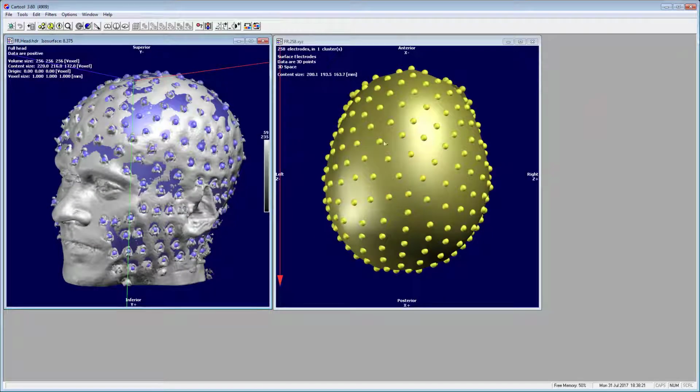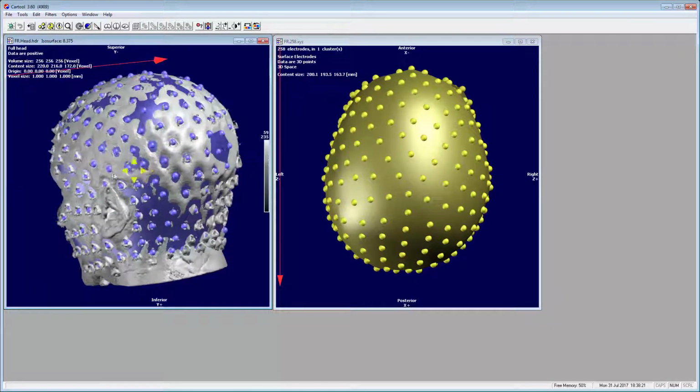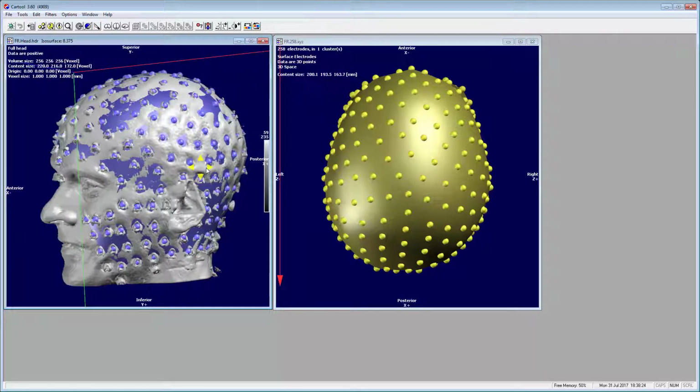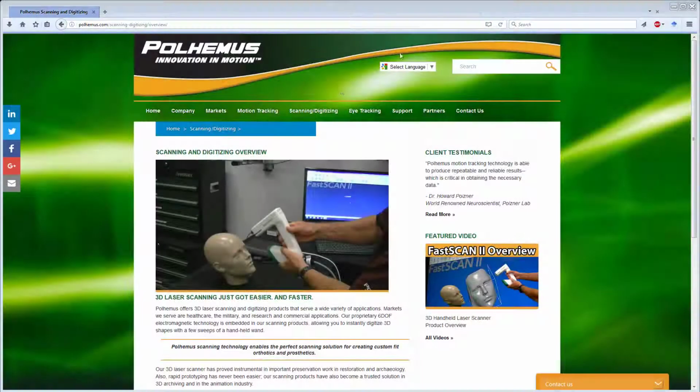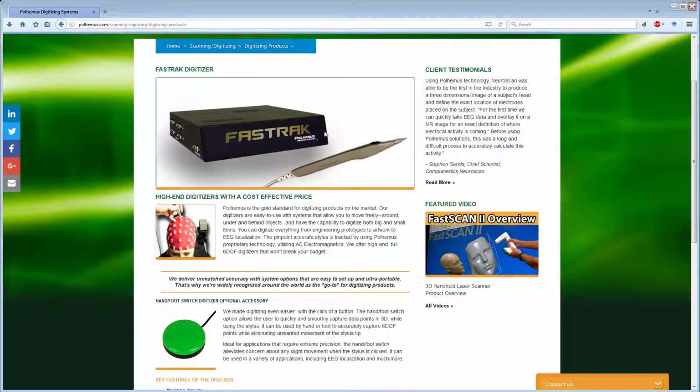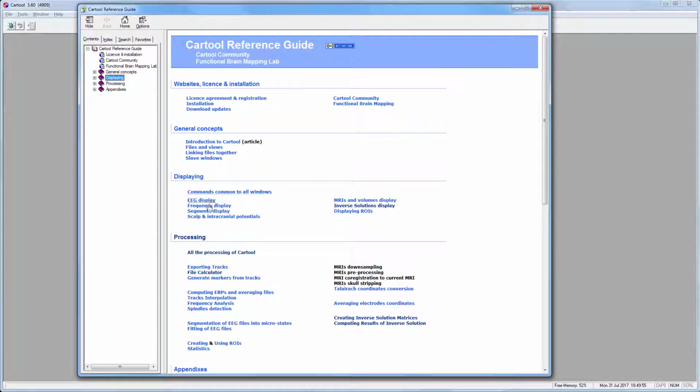First scenario, you can recover the subject's actual electrodes positions. This is definitely the best case, as head shape can vary greatly among individuals. You can measure the electrodes positions by using a sensing device like Polhemus, for example. You will have to convert the output of this machine to a XYZ file.